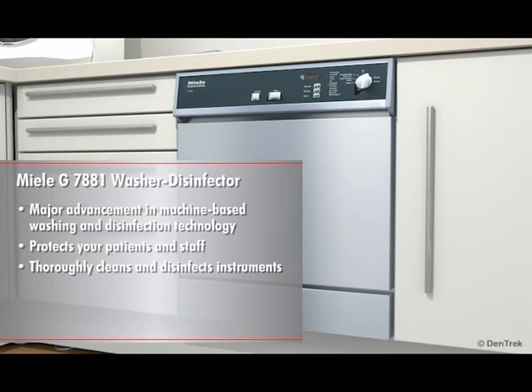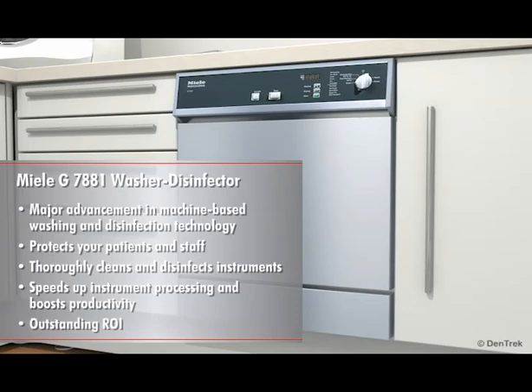So that the autoclave can effectively complete the sterilization process. You will also see how using the Miele G7881 speeds up instrument processing and boosts productivity, making it a smart purchase with an outstanding return on investment.